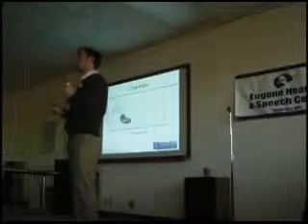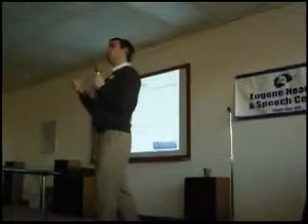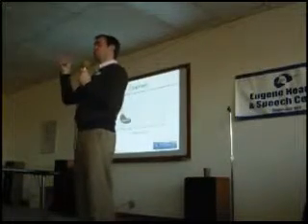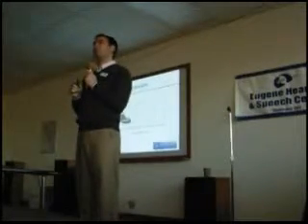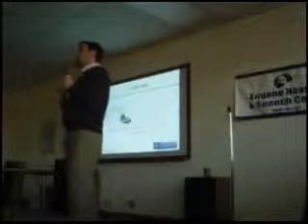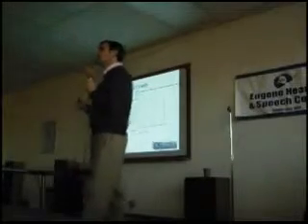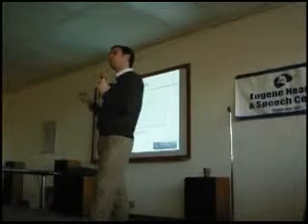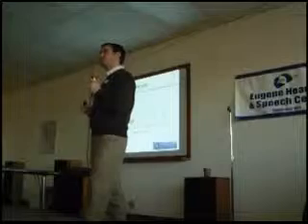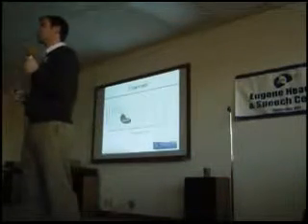But I want to make sure that you don't walk out thinking more channels is automatically better, because that's not always the case. Channels help a lot in reducing some fan noise, but channels by themselves are not going to make a hearing aid better when it has 20 channels compared to one that has 8 channels. It's one part of it.